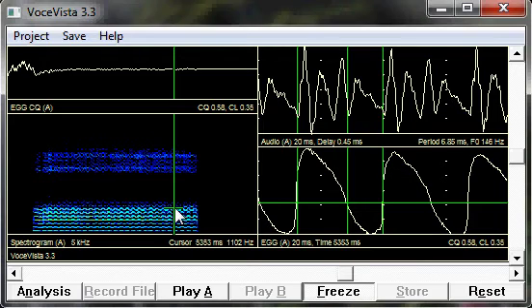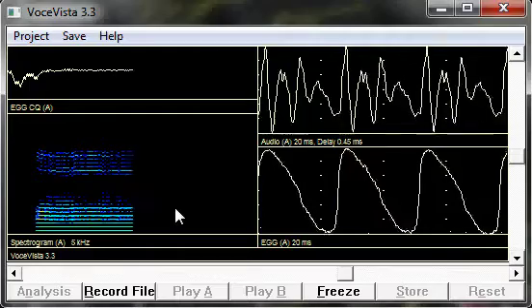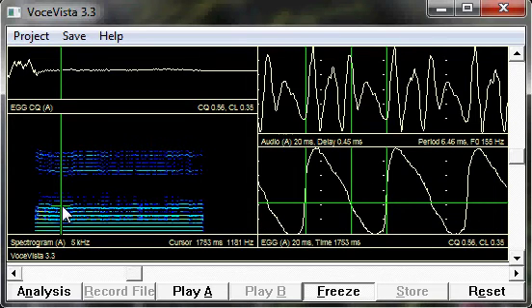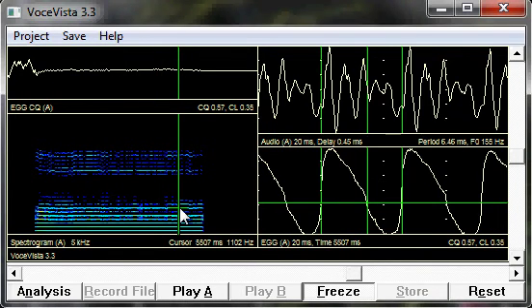Now you're going to repeat this process using the same pitch, but now singing a tone without vibrato. You won't need to readjust the CL reading, but you do need now to take your CQ readings. And in my case, as you see in my different locations, it's staying at about 56 to 58, which means that at this low pitch, my CQ for my vibrato condition and my non-vibrato condition were really the same.